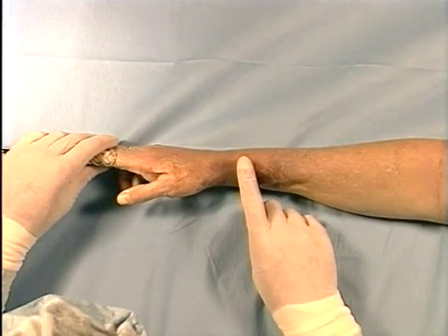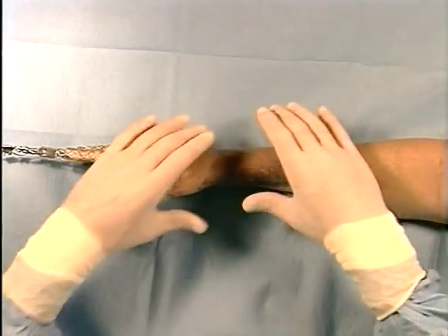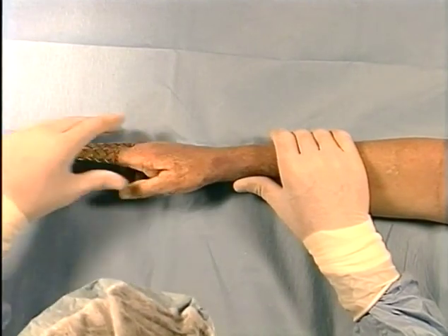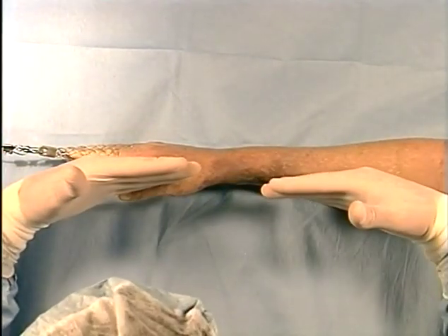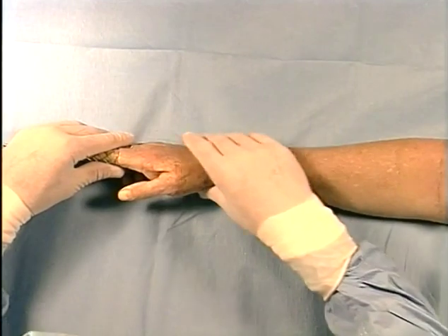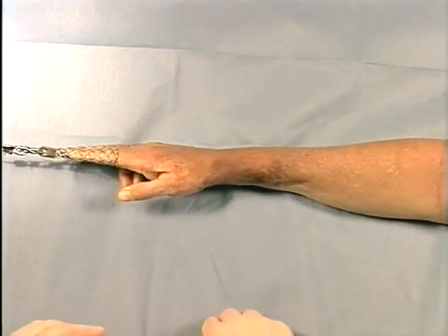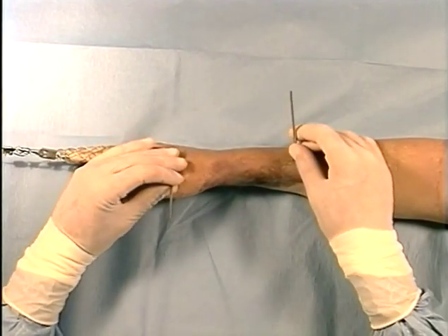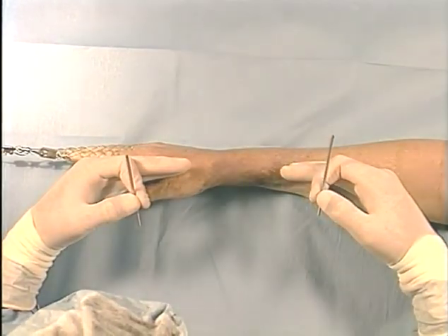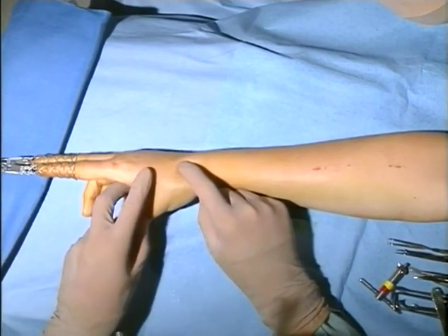When we treat a distal radial fracture with an external skeletal fixator such as the wrist jack, it's important to both do an initial manual reduction of the fracture with the surgeon's hands, but then place the patient in finger trap traction during surgery so that the longitudinal traction forces utilize the soft tissue envelope to help mold the fracture back into overall gross alignment and to assure that when you place the skeletal pins proximal and distal to the fracture site, they are in the best rotational alignment. Distally, we favor placing our skeletal pins into the radial base of the index metacarpal and into the distal shaft of the index metacarpal.